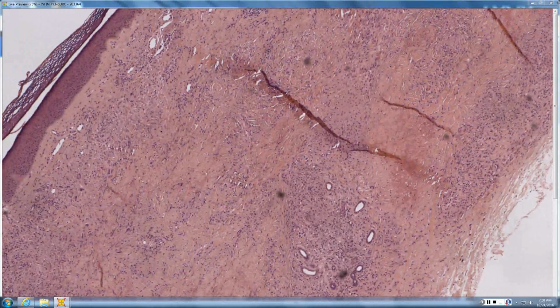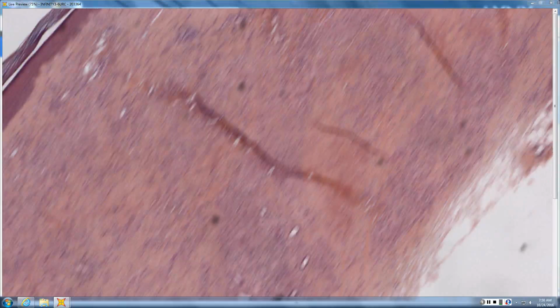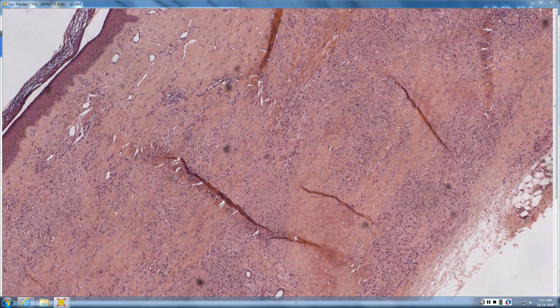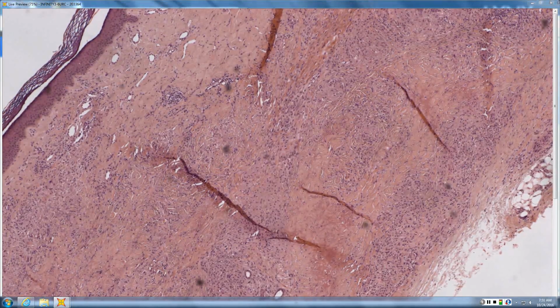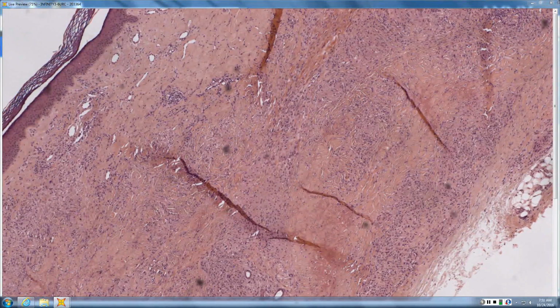The only thing that's odd for that is what's this intensely staining stuff here? Is it fibrin? So what kind of granulomatous conditions have fibrin? Like a rheumatoid nodule? So rheumatoid nodule and deep GA. I would then add to the diagnosis. So definitely NLD belongs in the differential, but with the fibrin, you have to consider deep GA and rheumatoid nodule, and the clinical picture that went with it is more of a deep GA. It doesn't belong in the chapter either.